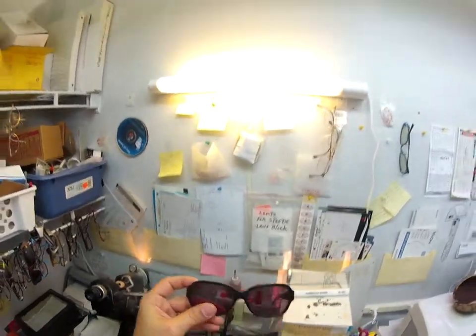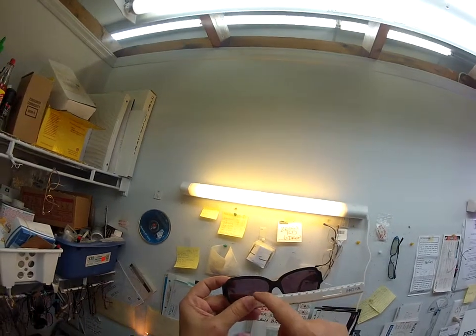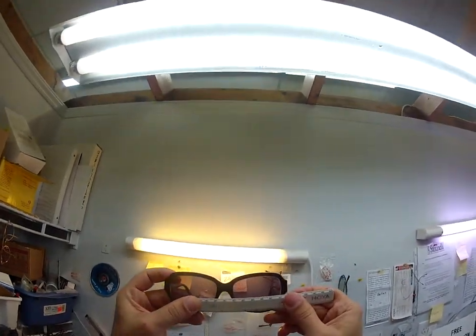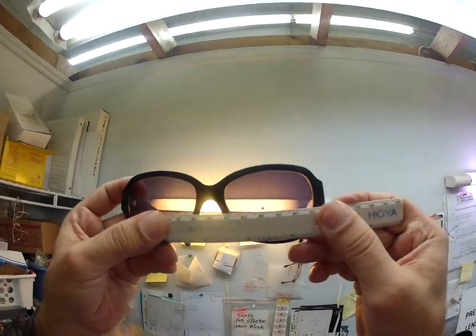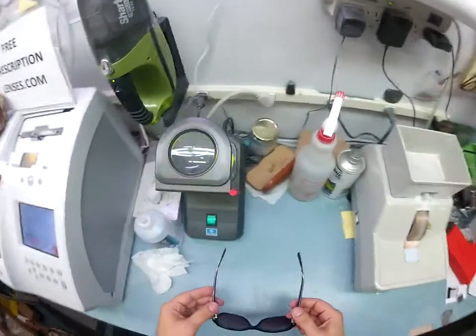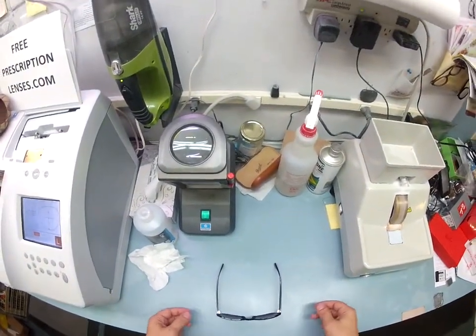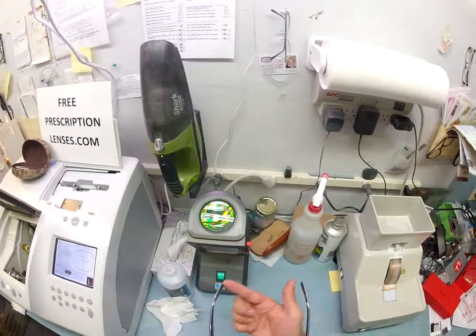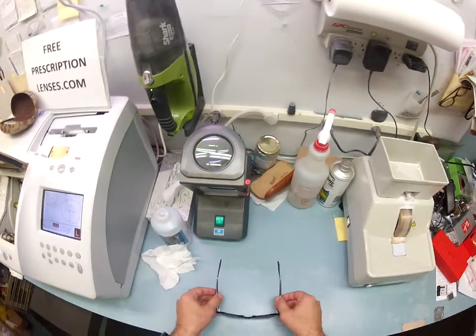So your pupillary distance is 60. I'm going to hold this up, and I'm going to put the 0 on your right lens, and as I hold this up over your left to the light, hopefully you can see this, but that reads 60 millimeters, so that we know is made correctly. I'm going to put your frame in standard alignment before I ship it to you. I'm going to set it on the counter and make sure it's in a 3-point stance. The 3 points are 1, 2, and 3. So I'm going to set it down there, push down. There is no wobble. I flip it over.